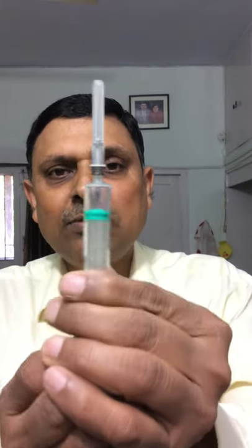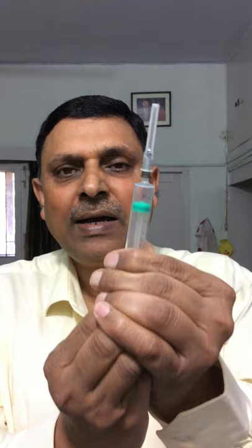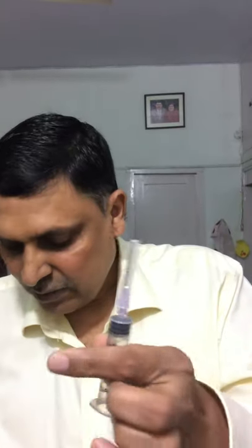How is it different from the ordinary syringe? With an ordinary syringe, you can push the piston and pull it back as many times as you want. But with a re-use preventable syringe, once the piston is pushed, you cannot take it back. If you try, it will break from the neck and come out. This important step has already been taken by the government by introducing RUP syringes throughout the state.